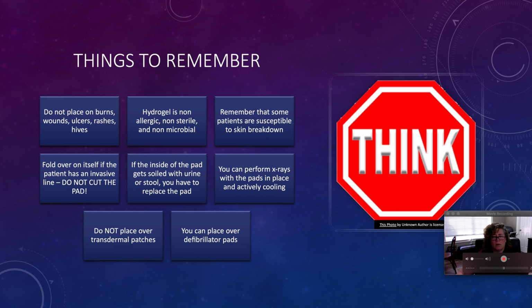That hydrogel that's located on the back of the pad is non-allergenic, but it's also non-sterile and it's not antibiotic, it's non-microbial. A lot of people think, oh, there's a rash, no big deal, I'll place it on top. You can still have skin issues and breakdown that might get missed and cause more problems. You can fold the pad over on itself if the patient has an invasive line. Please do not cut the pad. We've had people do that in the past. Water shoots out, it's a big mess, and then you have to replace the pad.